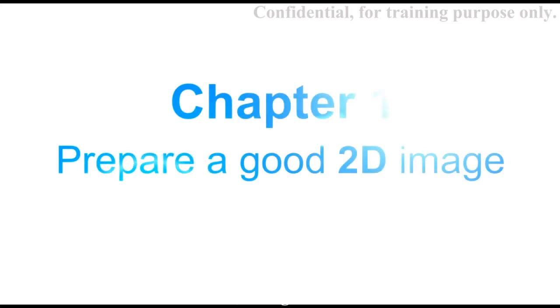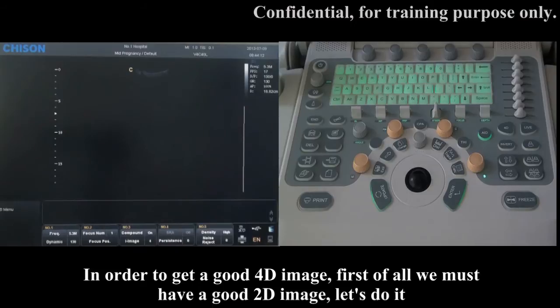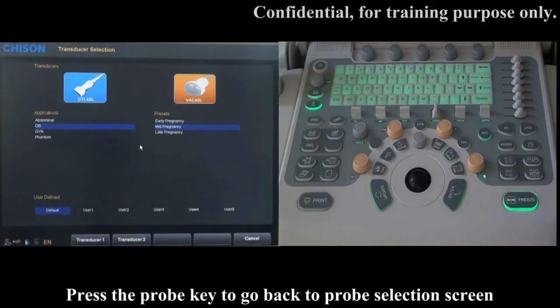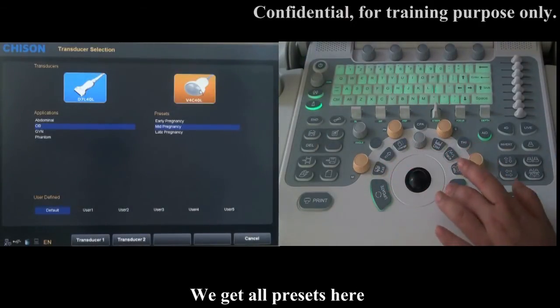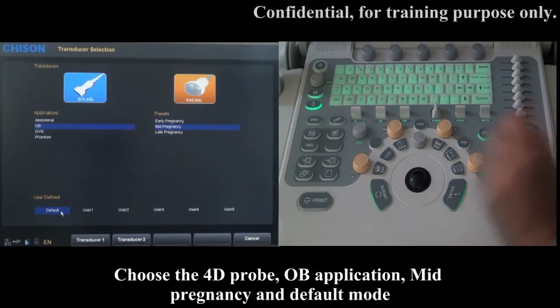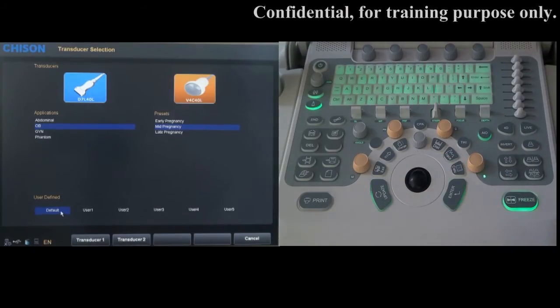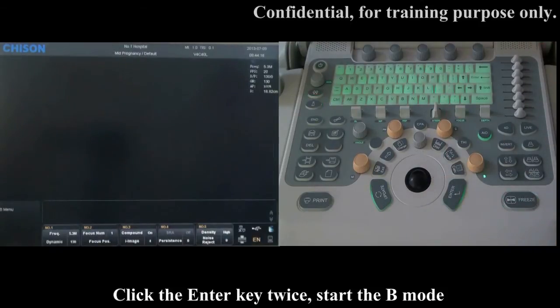Let's get started. In order to get a good 4D image, first of all we must have a good 2D image. Press the probe key to go back to the probe selection screen. We get all the presets here. Choose the 4D probe, OB application, mid-pregnancy, and default mode. Click the Enter key twice to start the B mode.